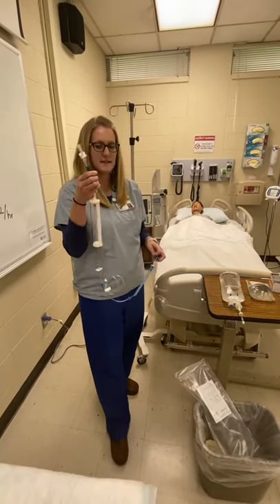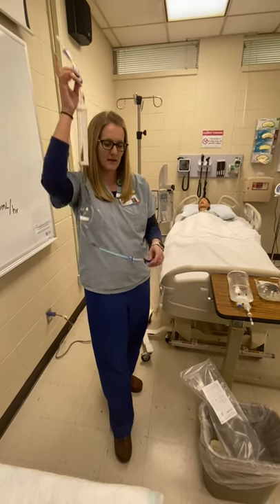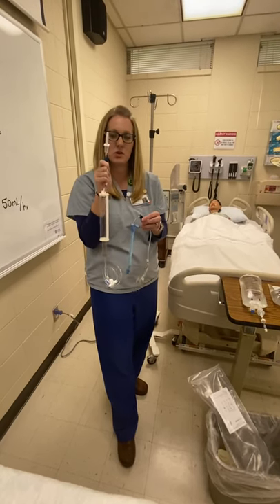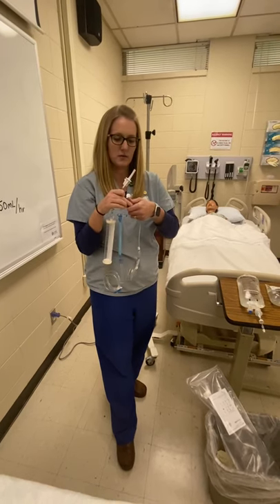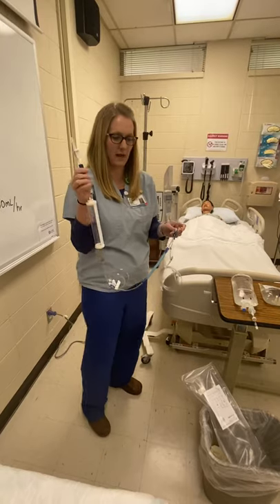You've got your buretrol. It's got two roller clamps — one at the top that will go to the bag, and one down below that will keep what's going to the patient. Both of them need to be turned off before you actually spike your bag on here, or you are going to get a whole lot of fluid and air in your line that you don't need.